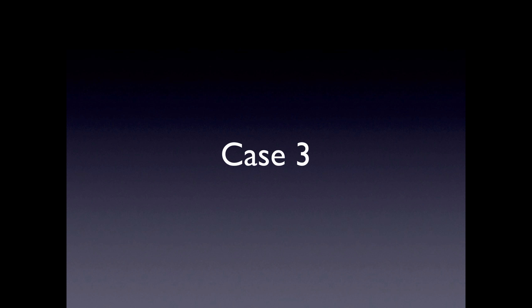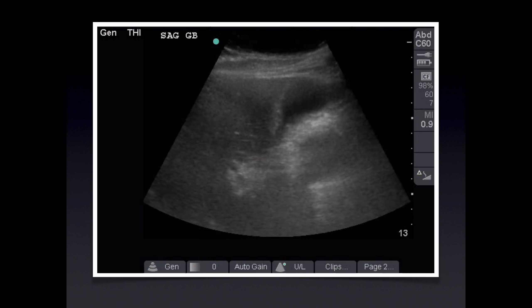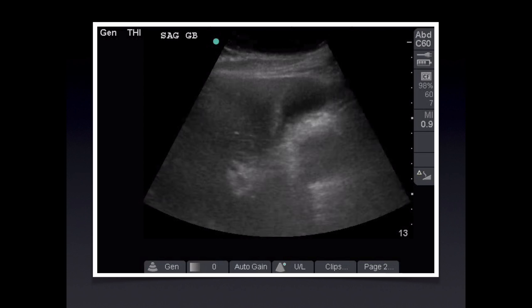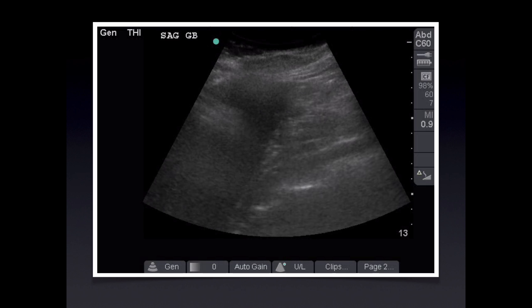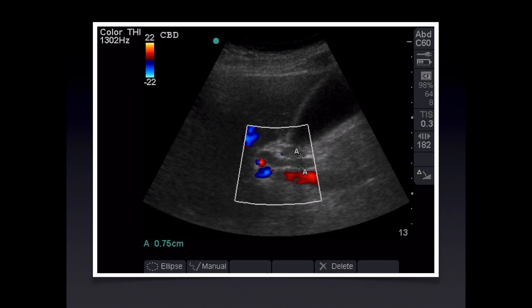Case 3: take a minute to look at the sweep. The gallbladder looks normal with nothing within it, but hopefully you see the other abnormality. The common bile duct appears to be pretty dilated. Color Doppler is often superimposed on the common bile duct to help distinguish it from other structures in the portal triad, because the portal vein and hepatic artery have flow within them and the common bile duct does not. The diagnosis is a dilated common bile duct.